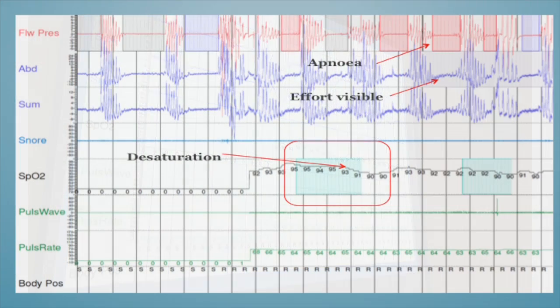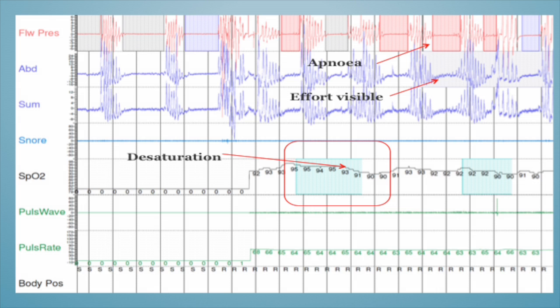Once we increase the channels, this trace is from somebody with Cheyne-Stokes respirations — someone with heart failure. You get a waxing and waning pattern of respiratory effort followed by a pause. What's happening is the carbon dioxide being breathed is triggering the changes. One of the CO2 centres is on the main aorta, so if there's not enough pressure against that baroreceptor, they start trying to breathe.